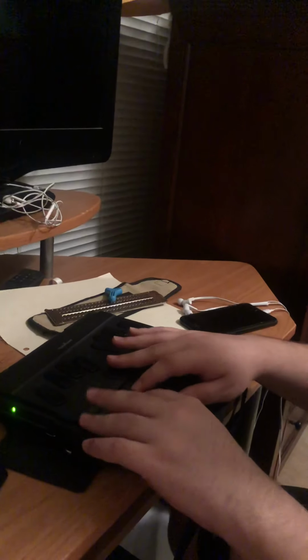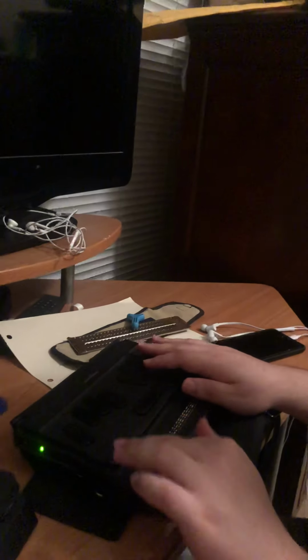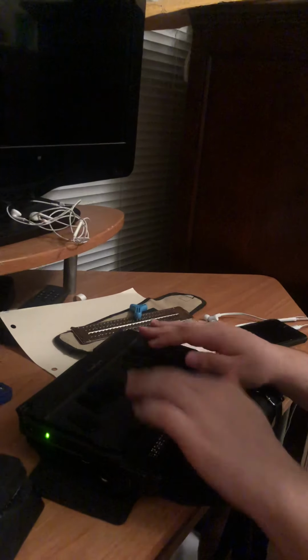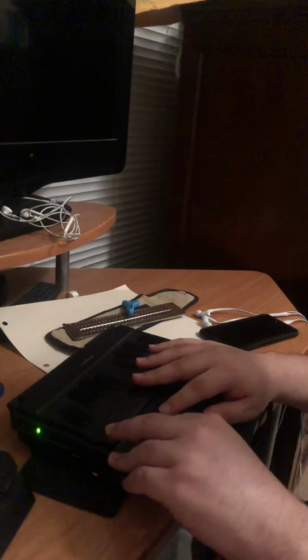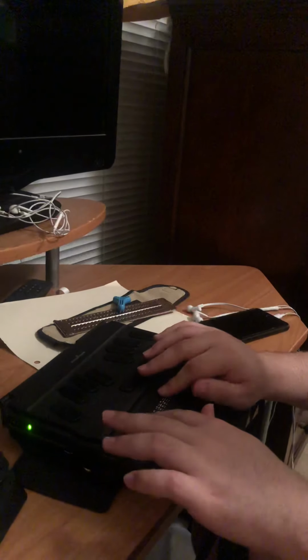Let me turn on my volume. Bluetooth on. Softer. Softer. Normal. Slow. Accessibility volume set to normal. Louder ringer vibrate. Okay. Wi-Fi 2 bars. So unlocked. Device unlocked.